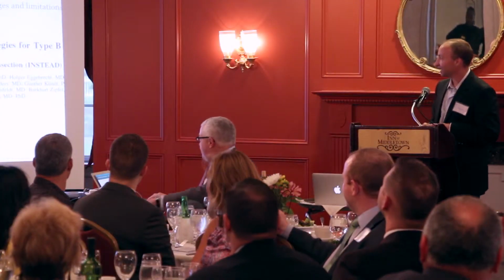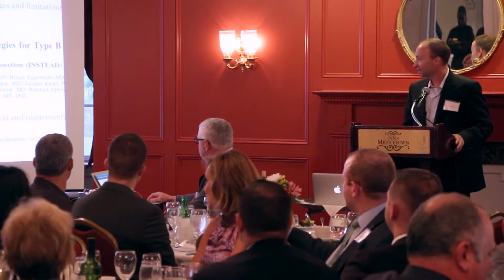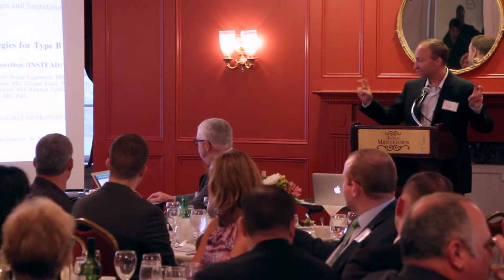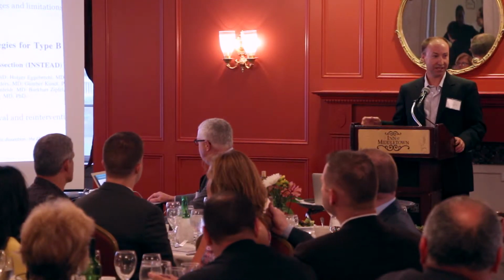And basically, it compared medical management versus stent grafts. And hit the button again. And if you go down, and I just put in quotes, at 2 years, there's no difference in rupture, survival, or reintervention if you get medicine or you get a stent.